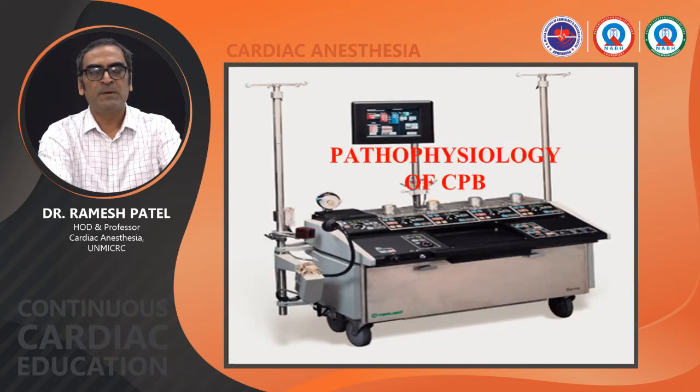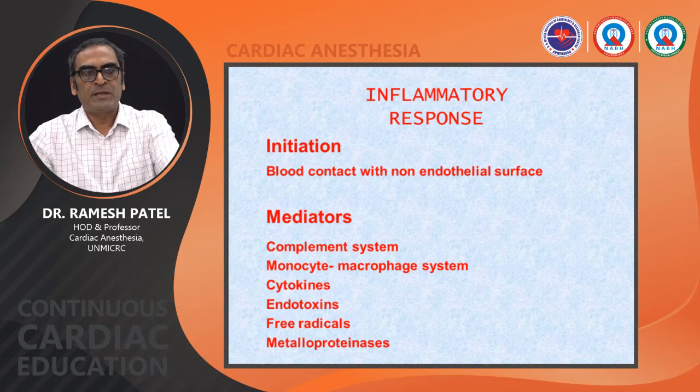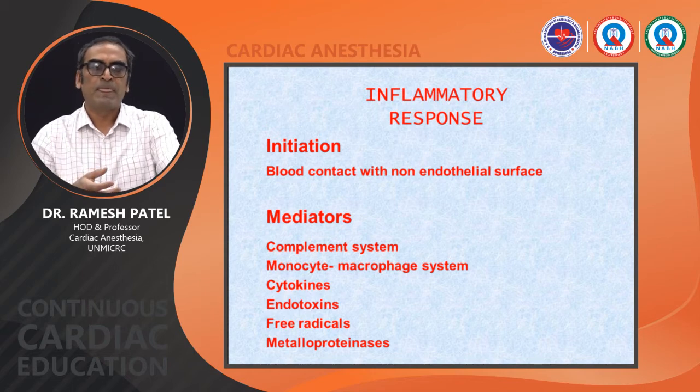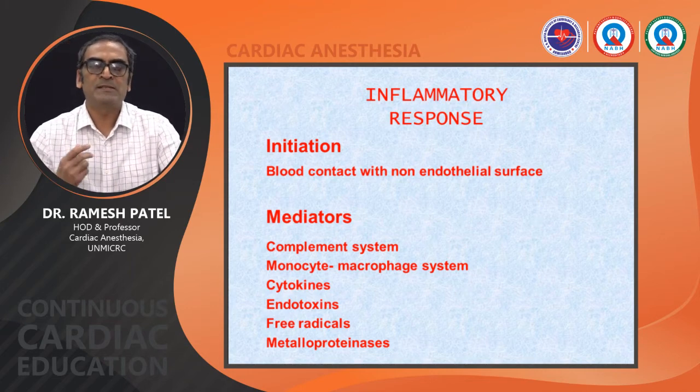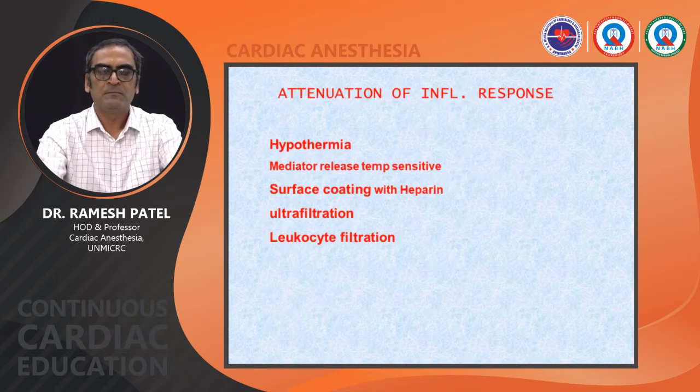I will discuss in brief the pathophysiology of cardiopulmonary bypass. As we know, all the volume of the body is exposed to an artificial surface which is not an endothelial surface. So a quite significant amount of systemic inflammatory response is going to happen. The mediators responsible for the inflammatory response are the complement system, monocytes, cytokines, endotoxins, and free radicals.